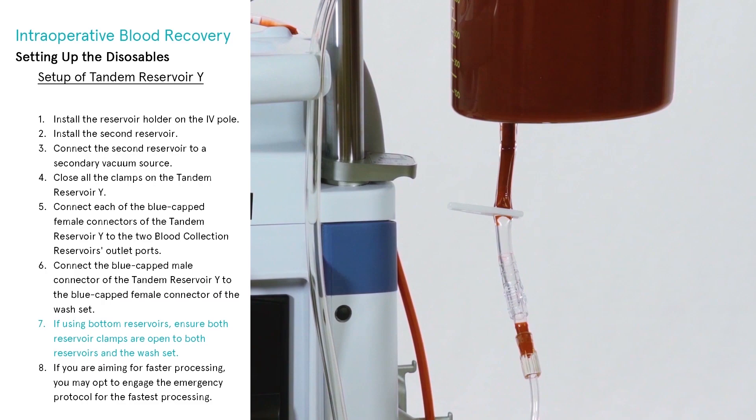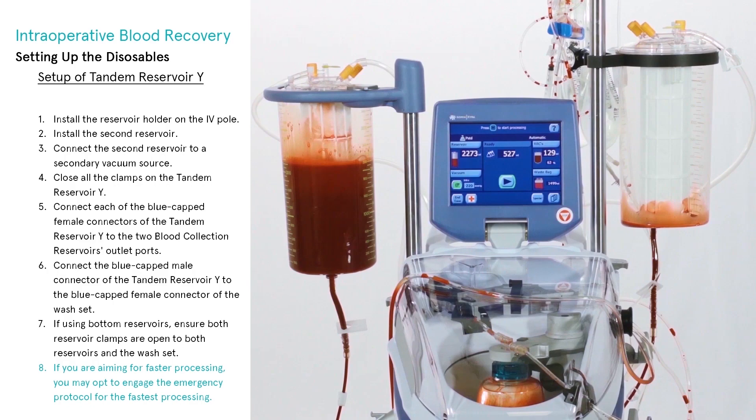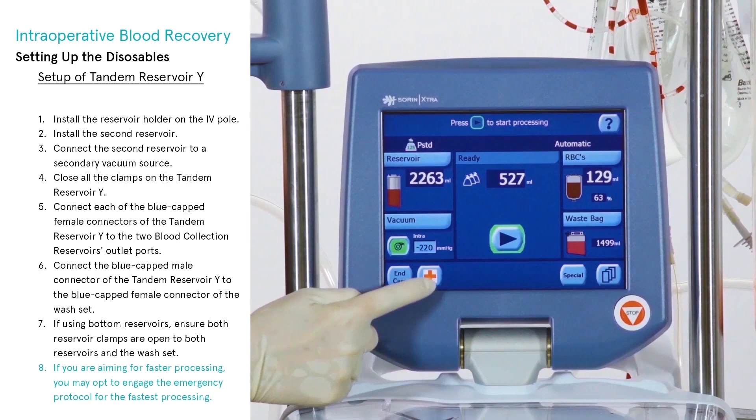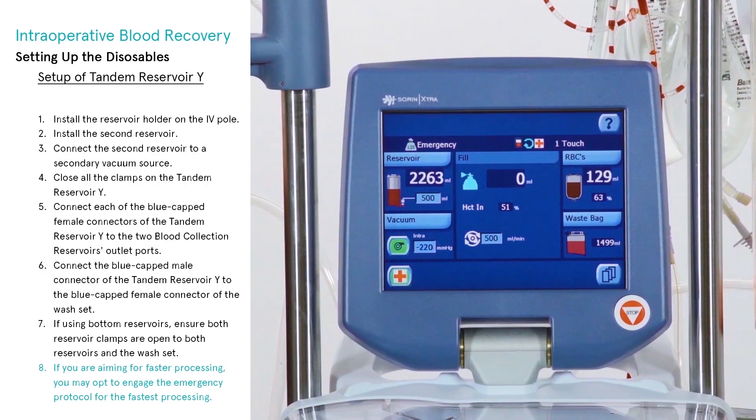If using bottom reservoirs, ensure both reservoir clamps are open to both reservoirs and the wash set. If you are aiming for faster processing, you may opt to engage the emergency protocol for the fastest processing. Warning: when processing blood, make sure that there is never more than one unclamped connection between a blood collection reservoir and the wash set at any given time. Attempting to simultaneously process blood from both blood collection reservoirs used in tandem may result in malfunction.